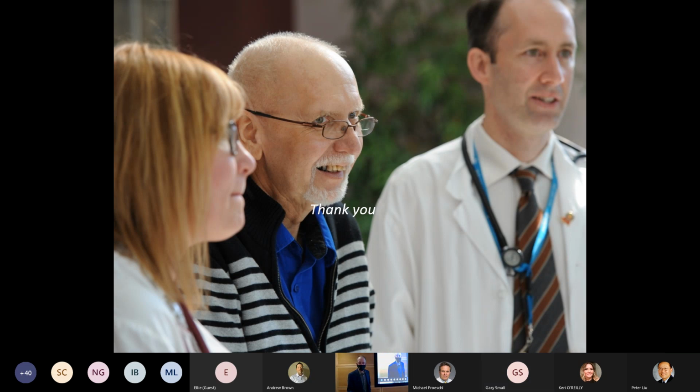Dr. Baruch? Yeah, thanks a lot, Ian. A lot of what you're looking at, these measurements by MRI, we can kind of get by echo as well. LV mass measurements, we can kind of get a measurement there. Lung water, we can measure filling pressures by echo. Do you have an idea of how MRI compares with echo? Do you have echoes in the same population? And is the MRI additive to what you can get from echo?